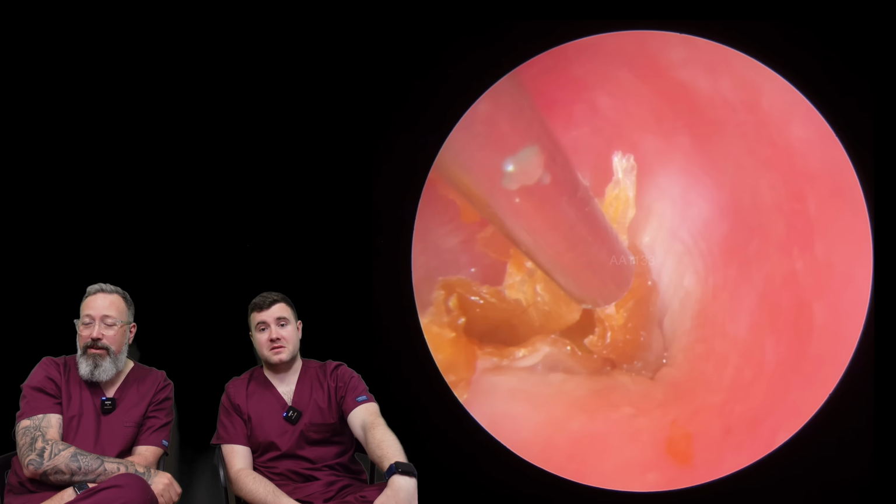You got that in quick, didn't you? It was taking a breath then. You got a chance. So with the fine head now, we're just trying to pull. You can see we're loosening. I think this is probably me now, because it's coming towards the end. Yeah. I'm trying to loosen this plug from the sides, because the forceps is just pulling through it at the minute.